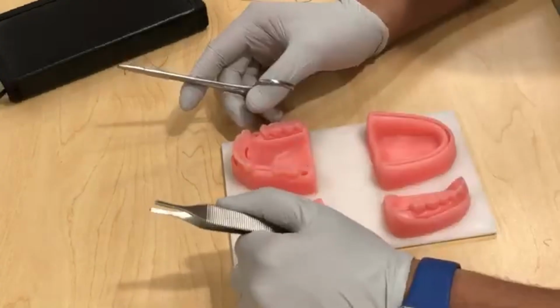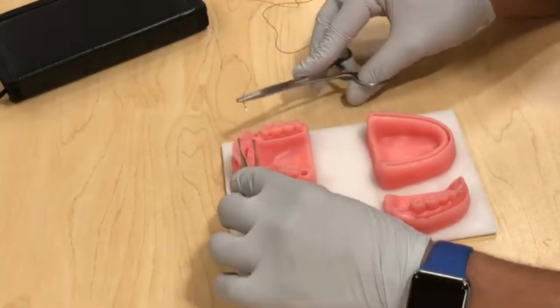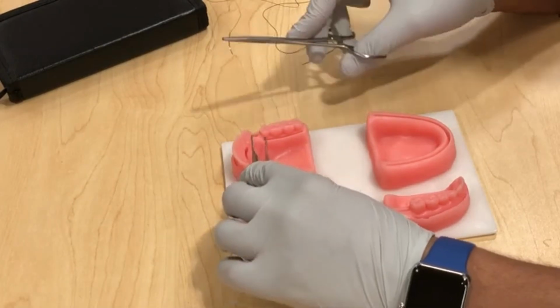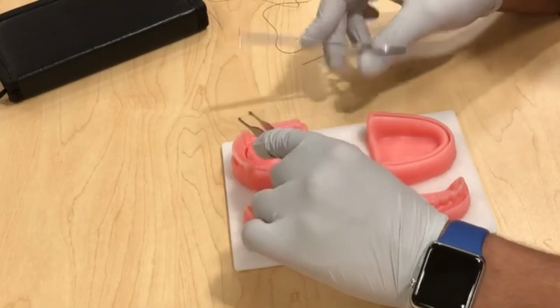So today we're going to start with the most basic suturing technique, which is the routine simple interrupted suturing. Usually you want to start from the buccal and go towards the palatal or lingual. So the knot ends up in the buccal, and that's very useful to avoid the displacement of the knot by the tongue.